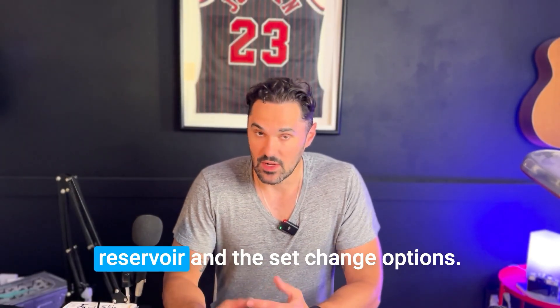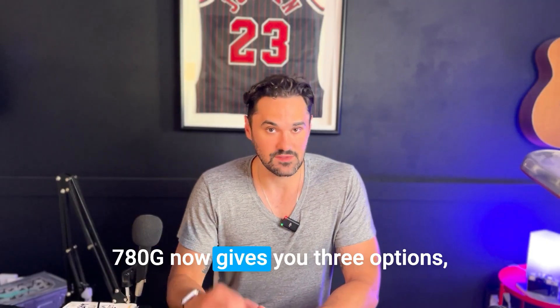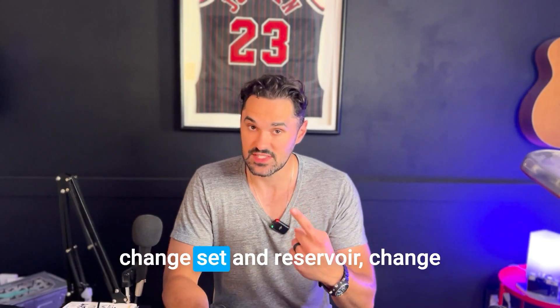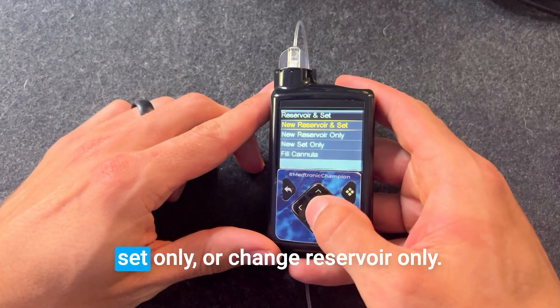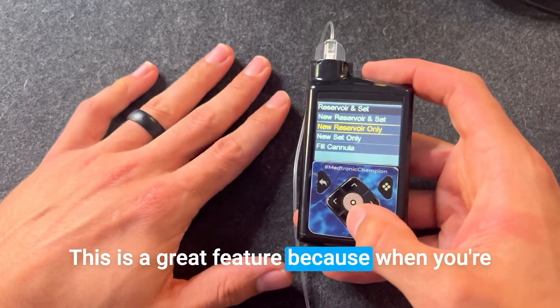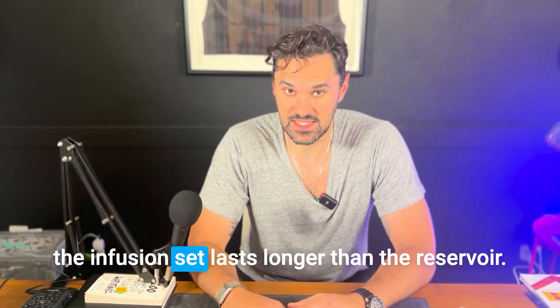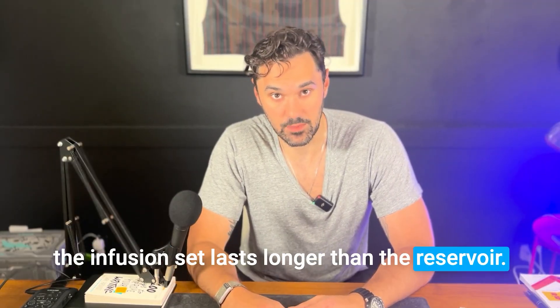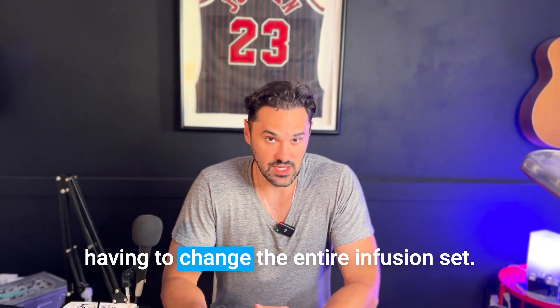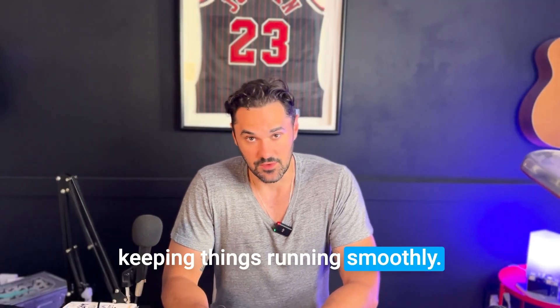First, let's talk about the reservoir and set change options. The MiniMed 780G now gives you three options: change set and reservoir, change set only, or change reservoir only. This is a great feature because when you're using the extended infusion set, sometimes the infusion set lasts longer than the reservoir. So you can change your reservoir without having to change the entire infusion set — it's all about flexibility and keeping things running smoothly.